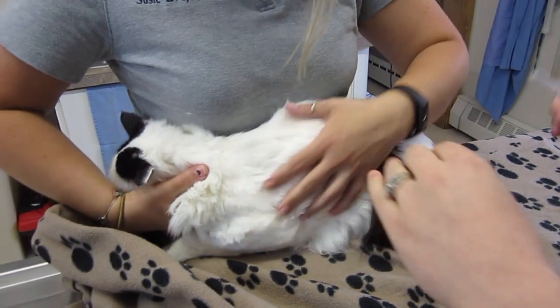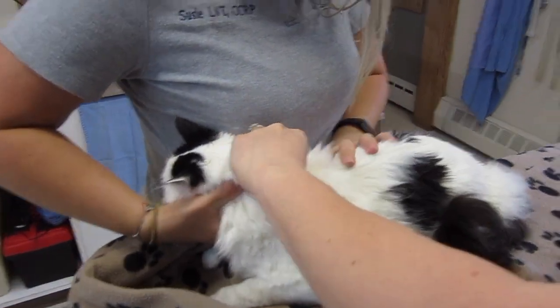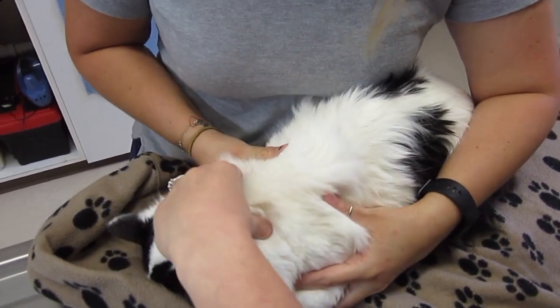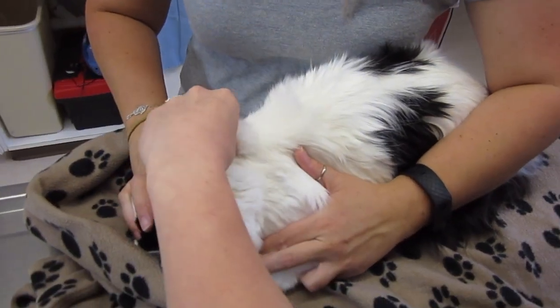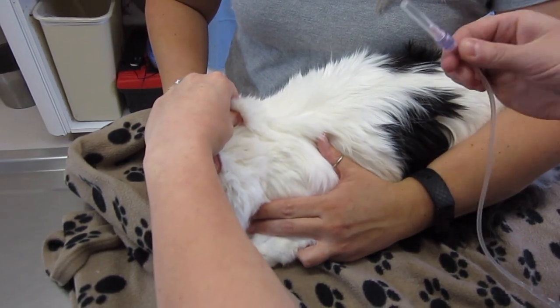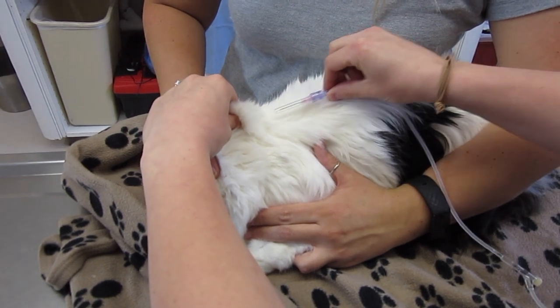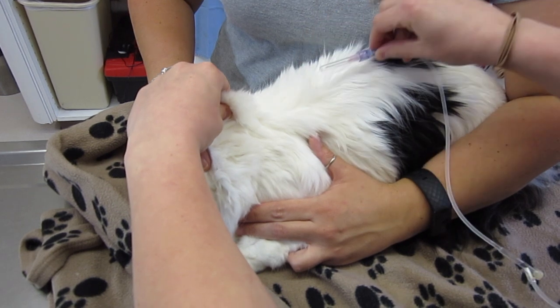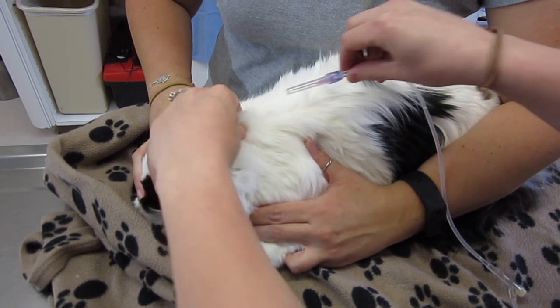You want to try and give the sub-Q fluids right near the scruff area of the patient, and this would be the same on a dog as well. Basically what you want to do is lift off the scruff and you want to tent the area. So I want to take my needle once I uncap it and go directly into the skin. I don't want to go down. I don't want to go side to side. I want to go parallel with the spine.